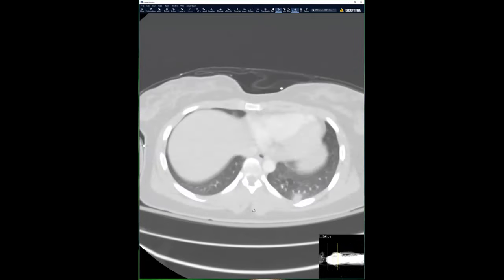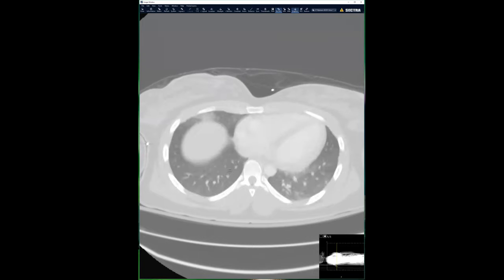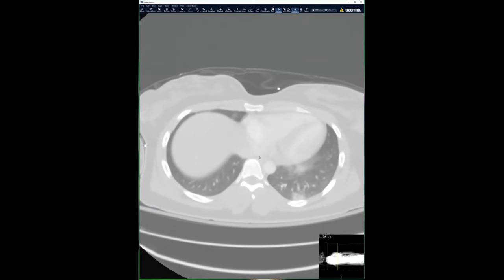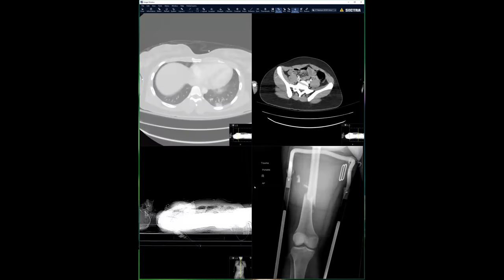Is there something about those lung findings that you would have suggested fat emboli? Typically, they don't have findings which you can say that these are fat emboli. But I have seen a few cases. Many times, these are fluffy peripheral lesions. Other than that, I don't know of any particular distinguishing characteristic just by looking at the emboli. So this is more of a history thing: does the patient have a history of trauma? We did see an embolus floating in the vein here, and this patient had a fracture.